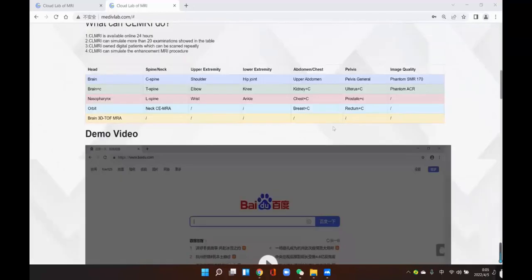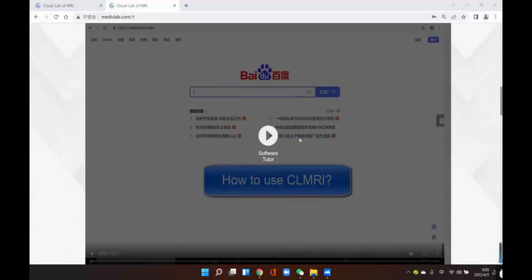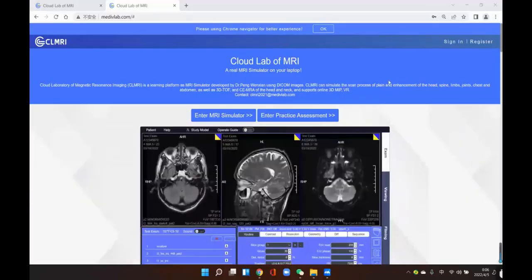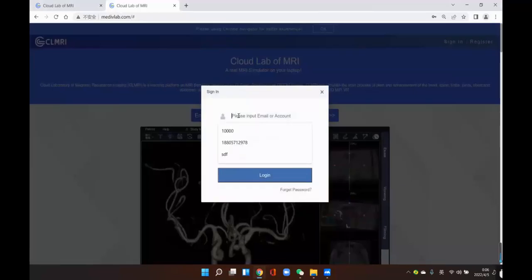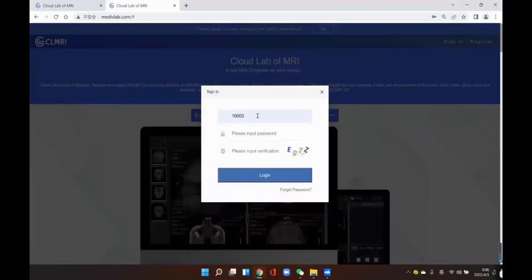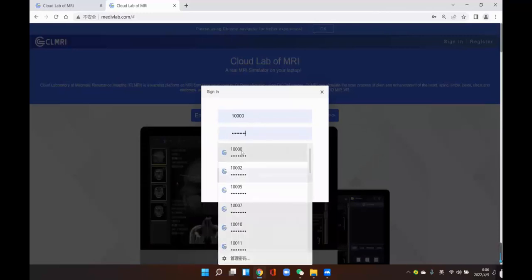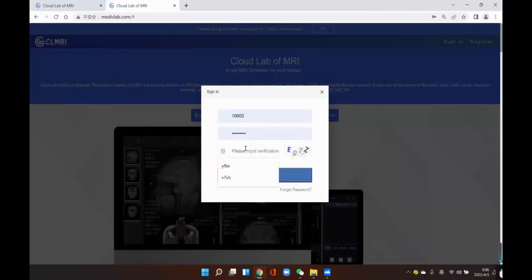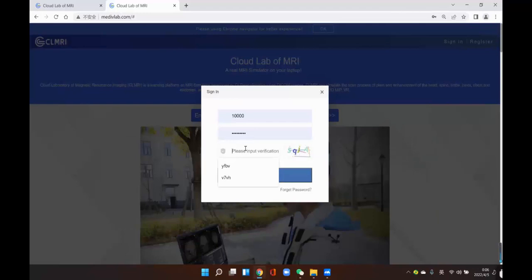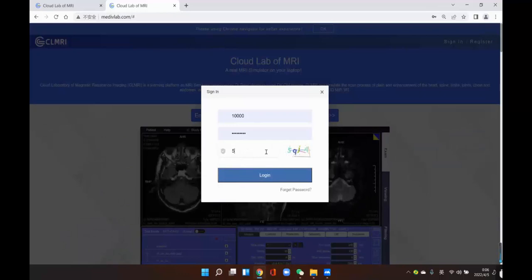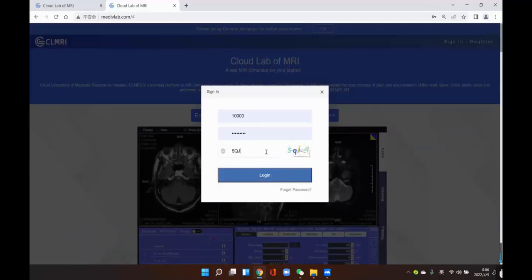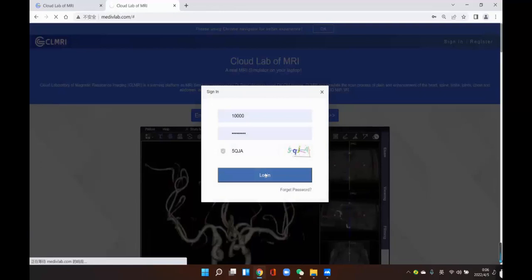We also provide a demo video here to show how to use CLMRI. Now let's start the software. You can click sign in or click MRI simulator directly. Then input your user ID or email address, your password, and the verification code from the right canvas. Input the number or letter, then log in.